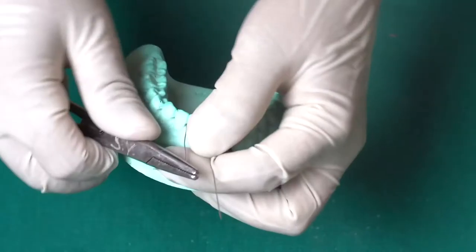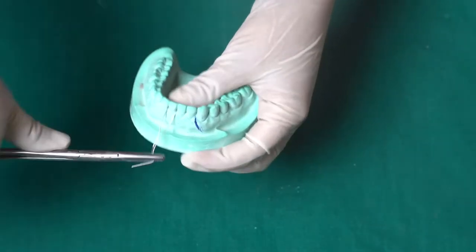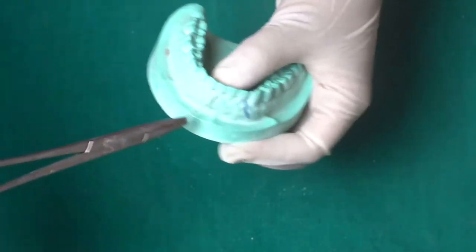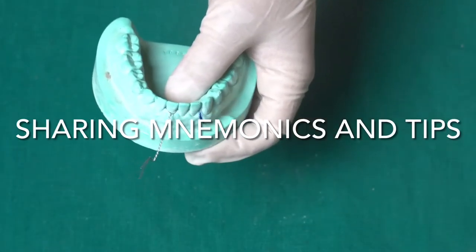Now take the twister. Both wires — from the mesial side on the lingual side and the wire you have taken on the buccal side — need to be tied together and then twisted. While twisting, twist in a clockwise direction.